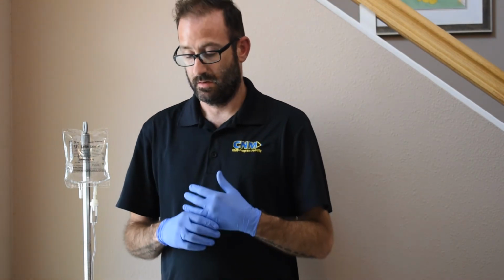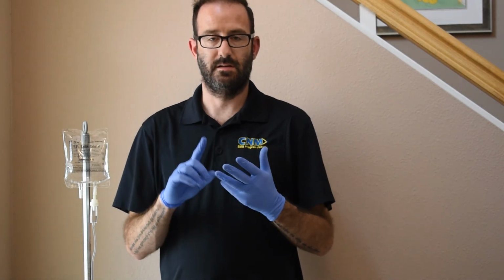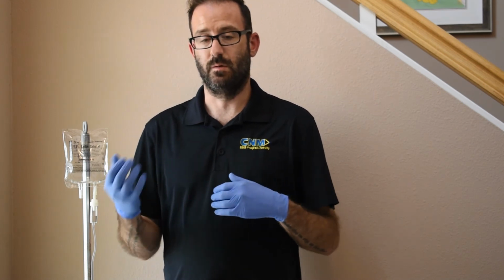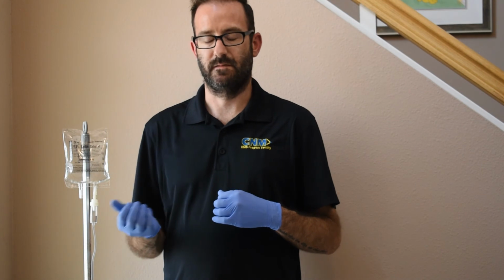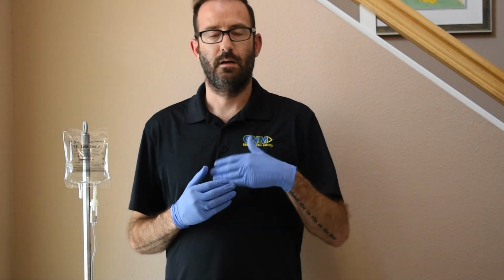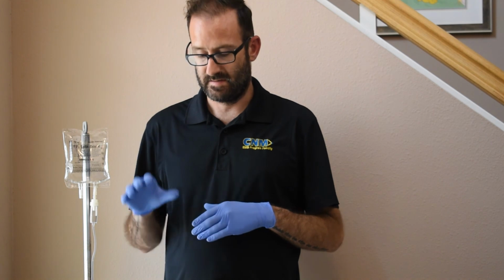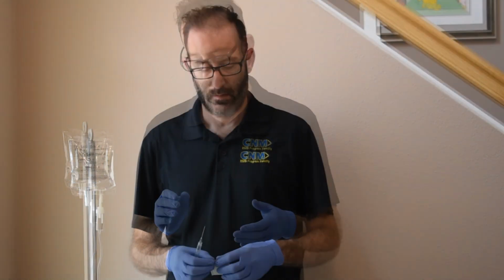I'm going to document everything that I just did, including the route, the medication, the dose, what time I gave it, as well as now I'm going to watch and reassess my patient, look for any desired effects or any adverse effects. I do expect Susie to start perking up a little bit more, coming back around, increased respirations, and that is IV med push using a needle port.